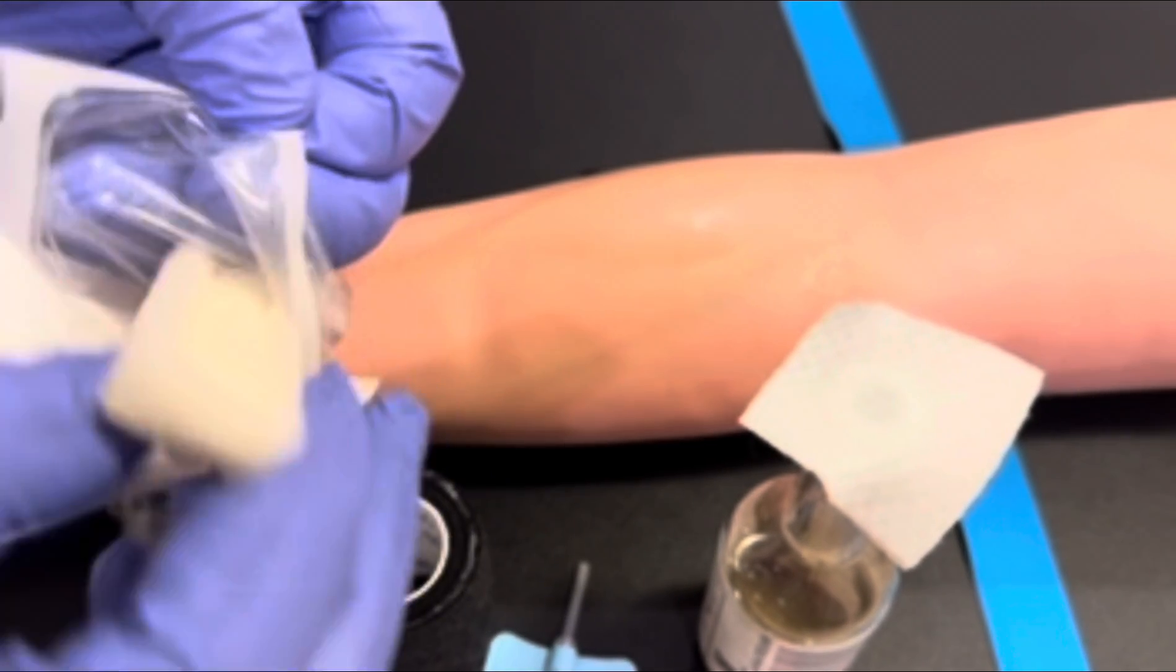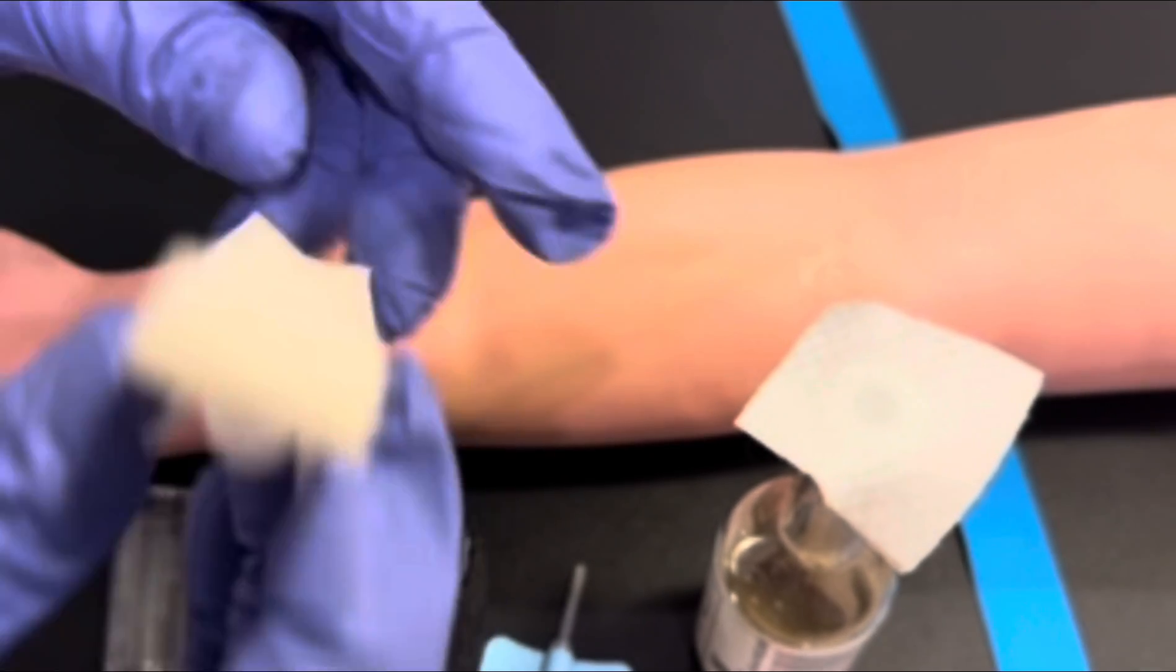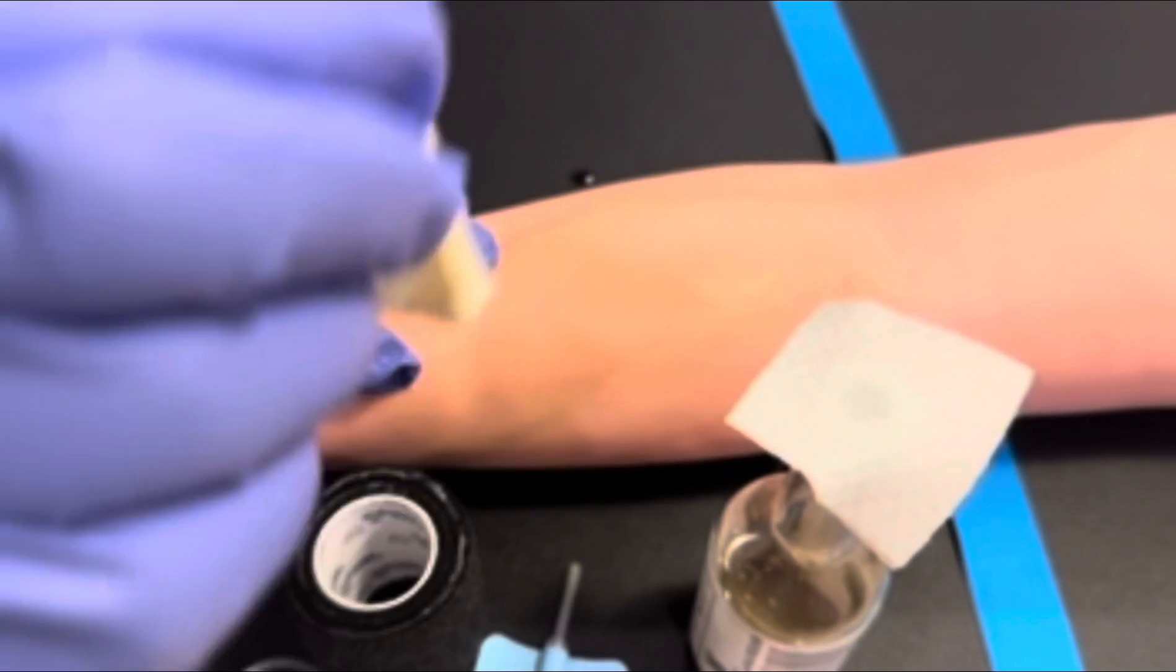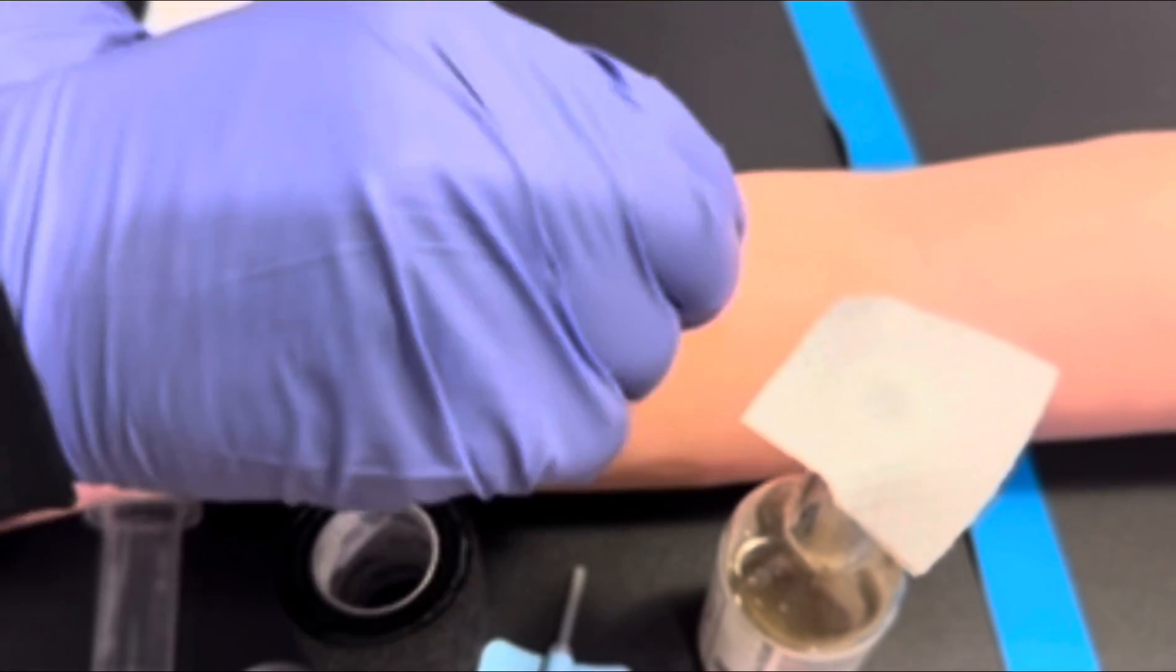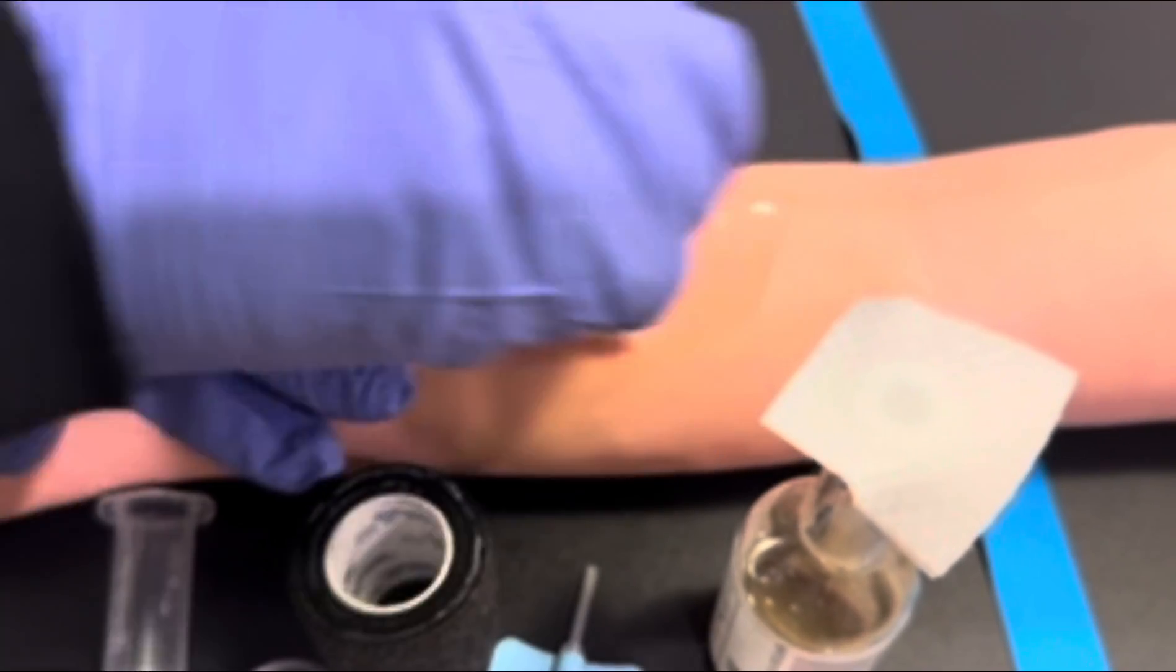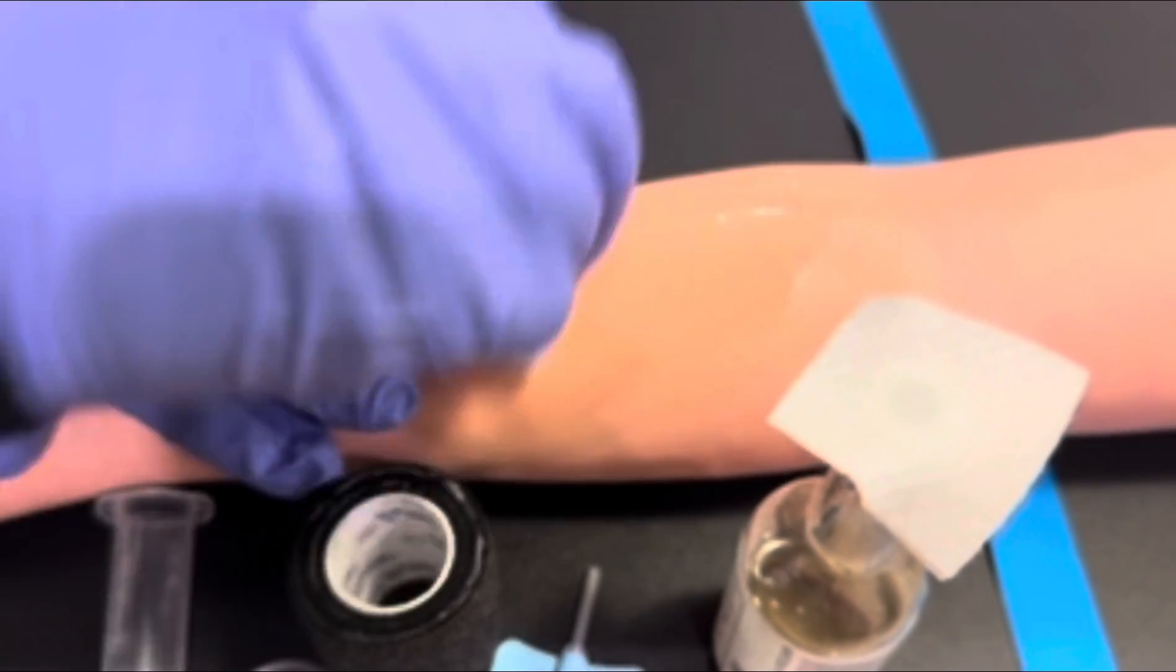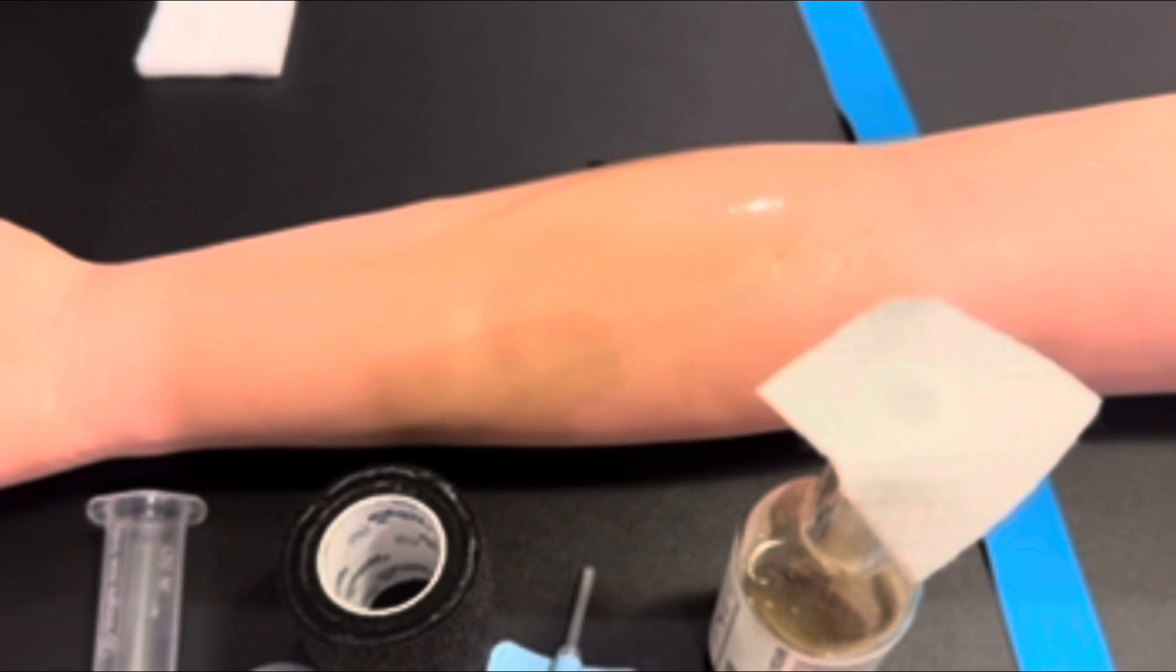This prep pad is called a chloroprep. It's a sponge applicator device. You'll snap the wings on the device, give it a little shake, and press and clean the site, or as we say, scrub and prep the site with the chlorhexidine prep pad for 20 seconds in concentric circles.